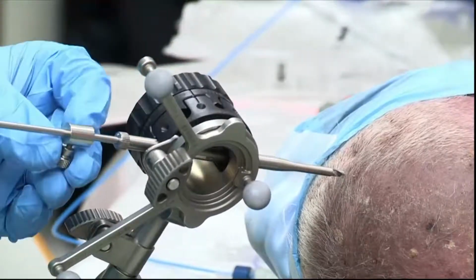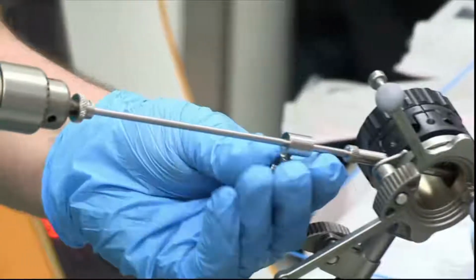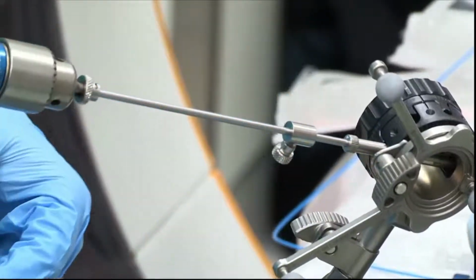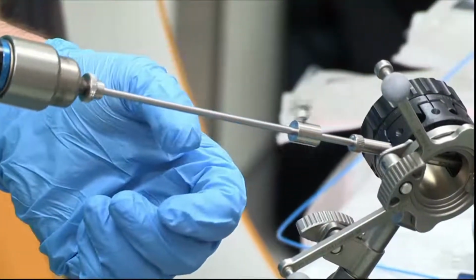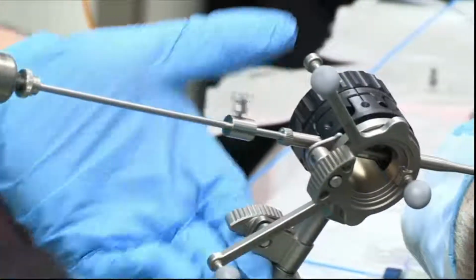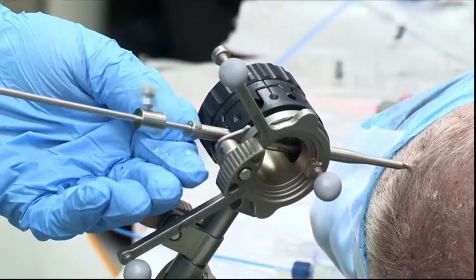All tactile, and you don't want to plunge. Once again, you can either have somebody irrigate your hands, and you want to have something to stop and keep your fingers here at all times so you're not going to plunge. We've already used the Steinman, which we didn't use this time. Oh, thanks. Yeah. Can I have irrigate, mop my brow.